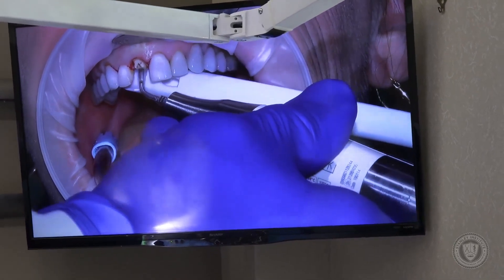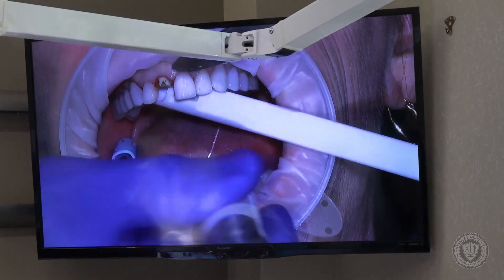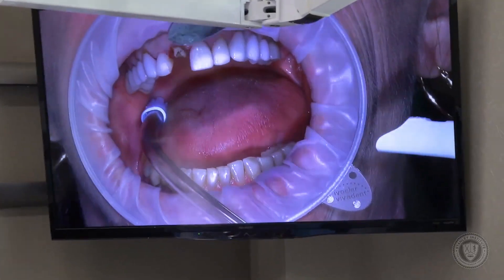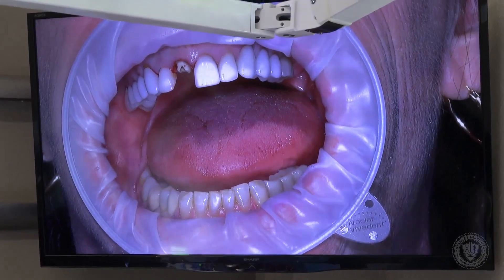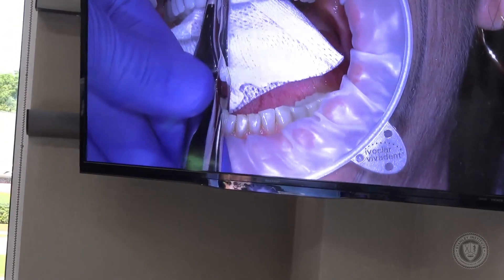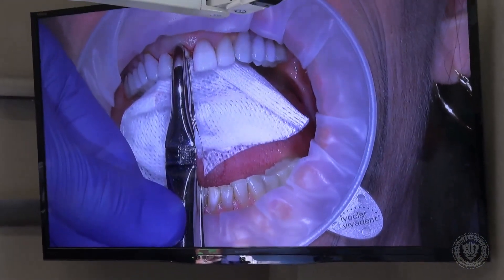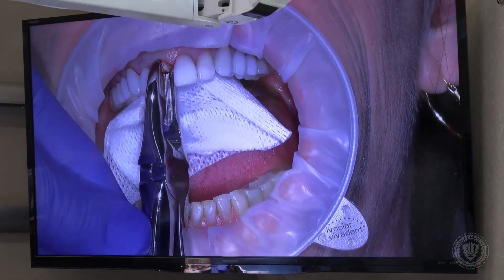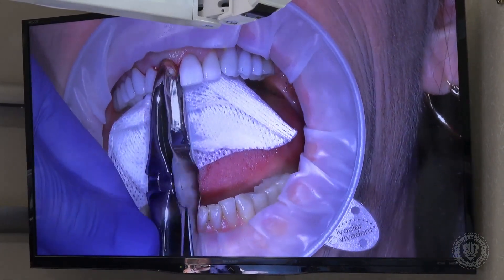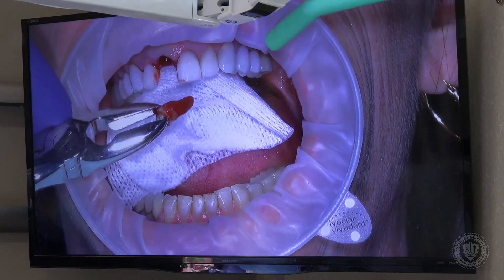I'm going to extend that now a little bit to the distal. Normally I would do interproximally, but in this case I really want to maintain that bone so we get a good result. Using our straight forceps, we're going to apply just a little bit of rotating force. And that's how we take out anterior teeth atraumatically. There are our root remnants out — that went just like we thought it would.